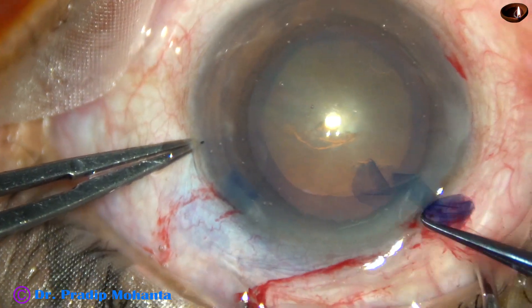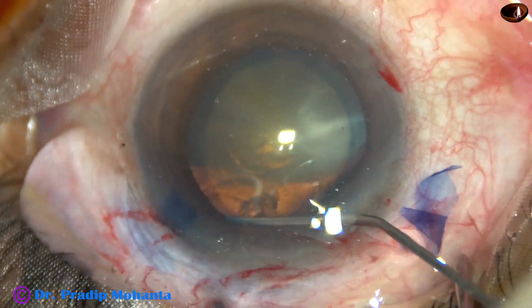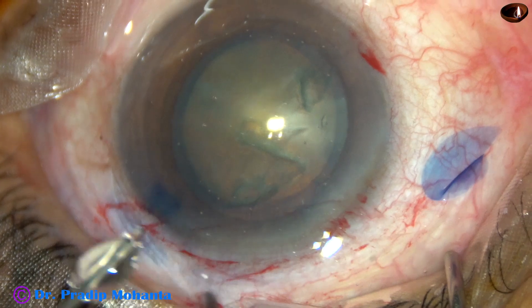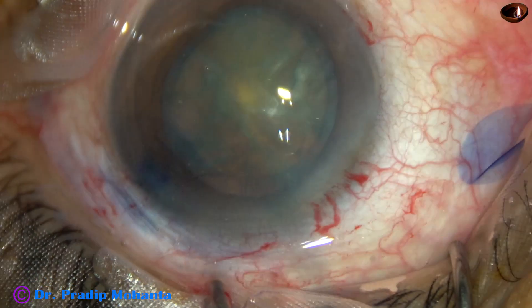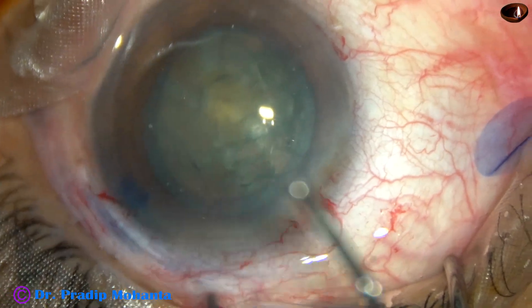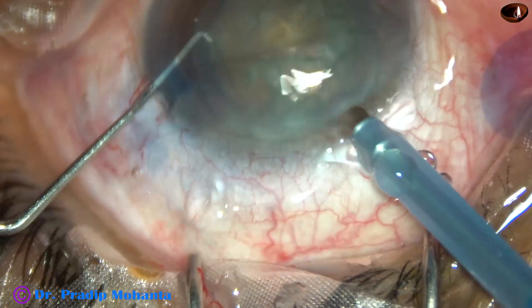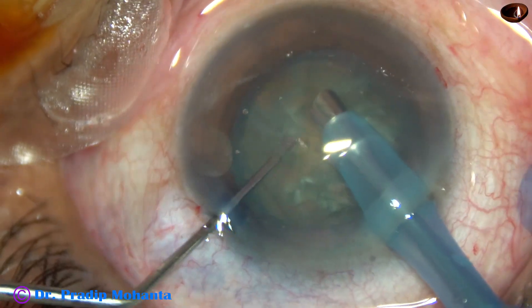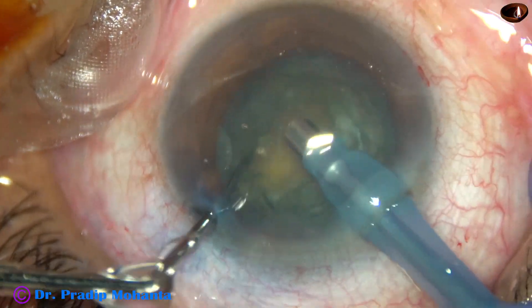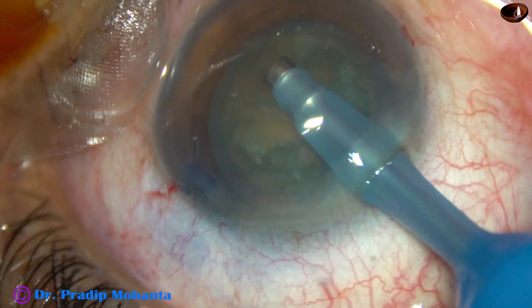An adequate-sized rhexis is made. The size of this rhexis is about 5.75 mm. In soft cataracts, do a large rhexis — nuclear management will be easy if you do a large rhexis. This rhexis of about 5.75 to 6 mm will contract over a period of time and will eventually overlap the optics of the intraocular lens. The nucleus is mobilized with some more viscoelastic, and then the tip of the phaco needle is introduced into the anterior chamber with bevel down. Some superficial cortical lens matter is aspirated, and then the nucleus is rotated clockwise a few times and anticlockwise a few times, which will facilitate aspiration of the cortical lens matter after nuclear management.